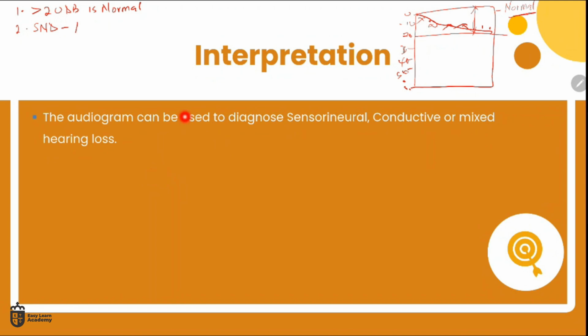So air plus bone affected. But how are they affected? Now, this differentiates it from another type of deafness. This is affected equally. So this is the second principle you have to know. When air and bone are affected, but affected equally, we are dealing with a sensorineural deafness.